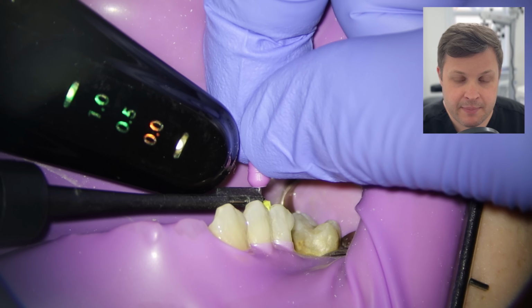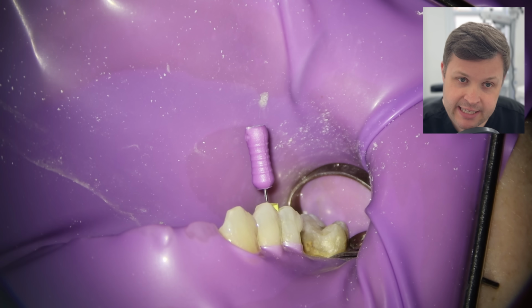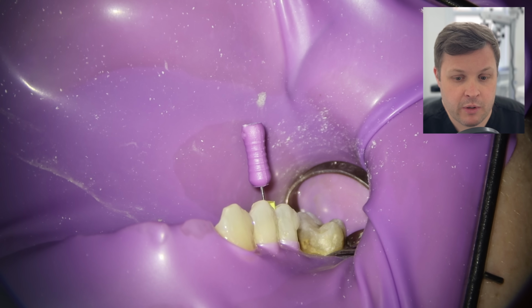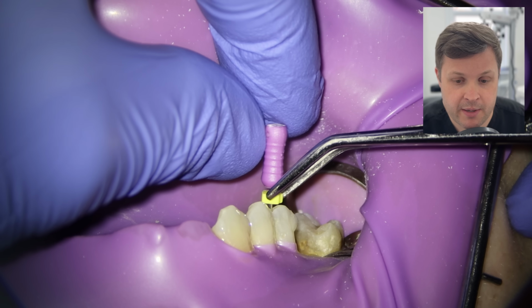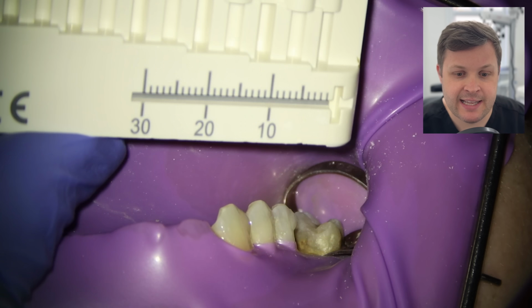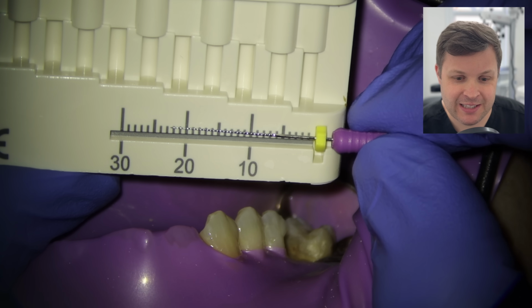A lot of the time, sometimes you're just not pushing it through the end, although what I would say is you've got to be careful, you can get a 0 reading and then go maybe 1 millimeter or even 2 millimeters more and have the same 0 reading. So in this case, I feel like I've got the correct reading. I'm just going to move the rubber stopper to a reproducible point, and then we're going to measure it, and the working length is found to be 22.5 millimeters. That's the 0. That's the point at which the hand file is at the periodontal ligament.